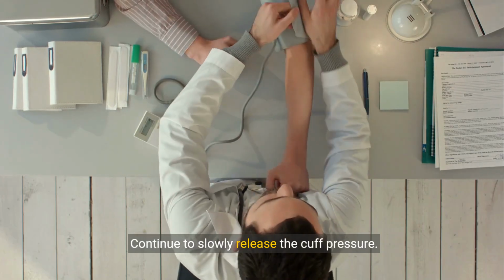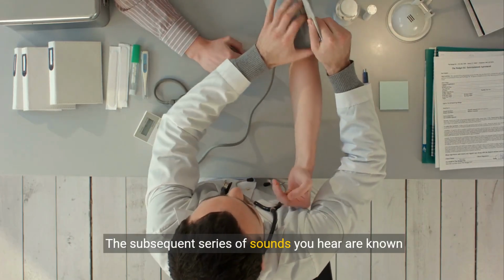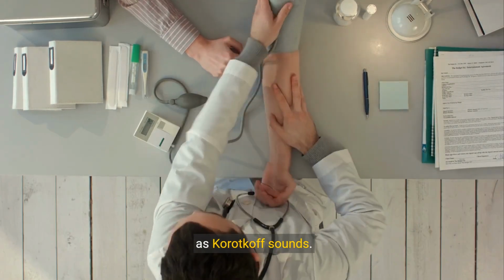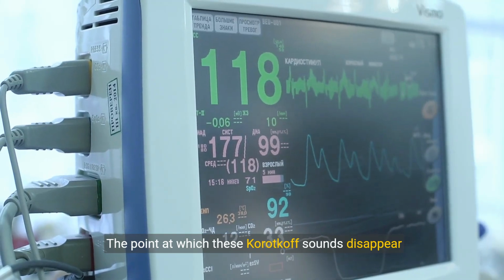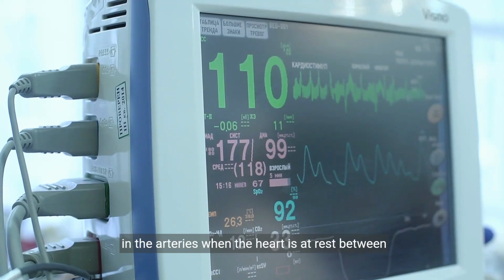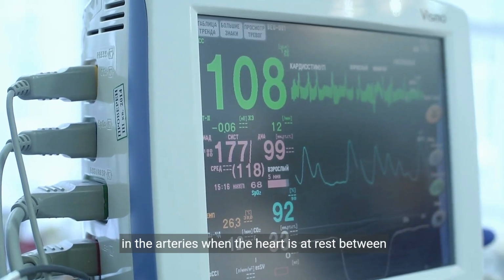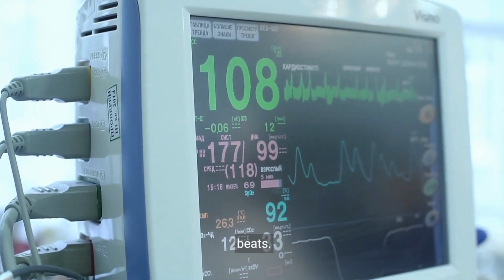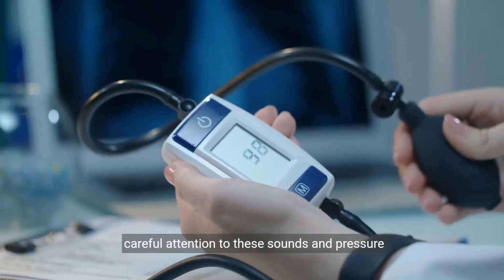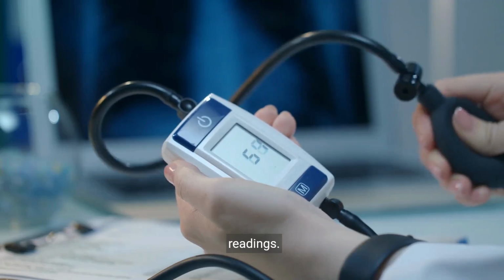Continue to slowly release the cuff pressure. The subsequent series of sounds you hear are known as Korotkoff sounds. The point at which these Korotkoff sounds disappear is the diastolic value, representing the pressure in the arteries when the heart is at rest between beats. Accurately measuring blood pressure involves careful attention to these sounds and pressure readings.